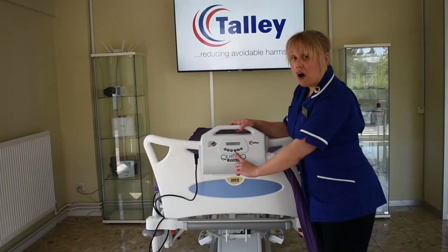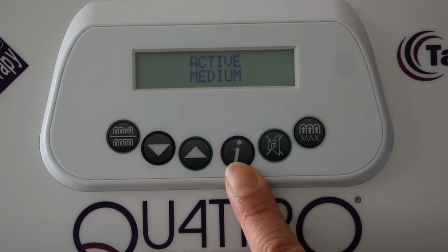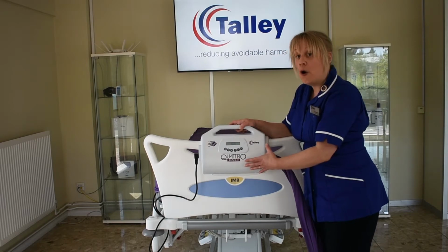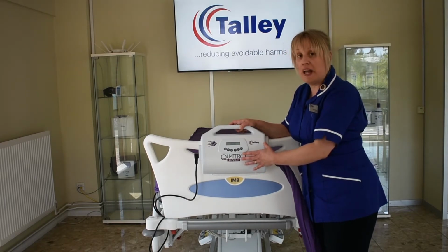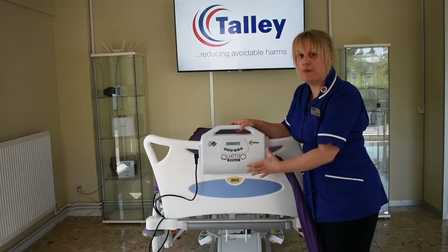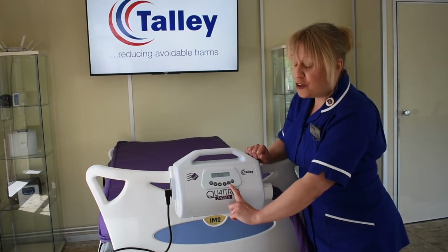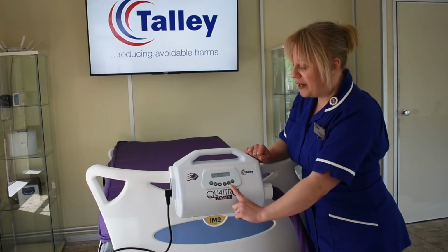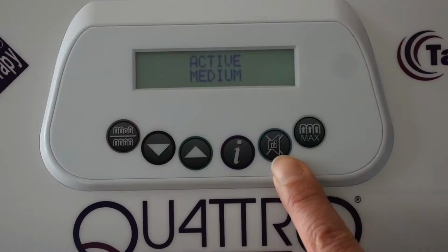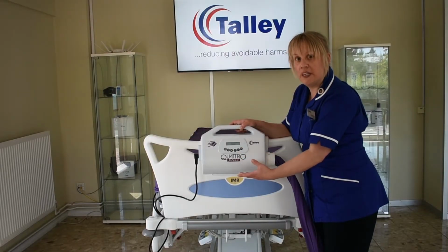If we move on to the I button, the I just stands for information, and that's information for the service team. As and when the service team may come and service the power unit, or they may want to look at any faults that may have occurred, they can use that button just to help resolve any problems as quickly as possible. Then moving on to the dual function button, we've already talked about how it can unlock your power unit, but it can also mute any alarms that occur. So if your power unit alarms for whatever reason, you just press the button once and it will mute the alarm.